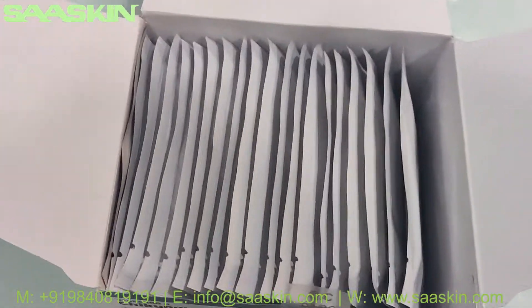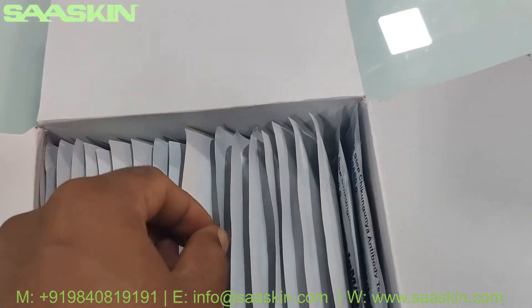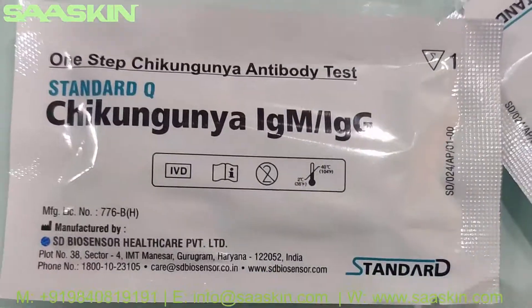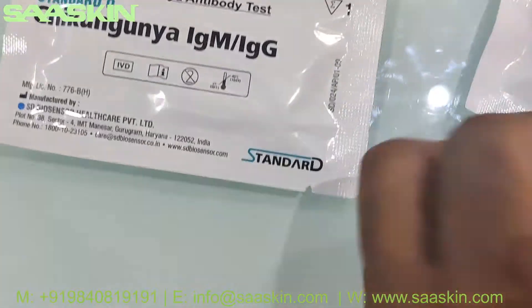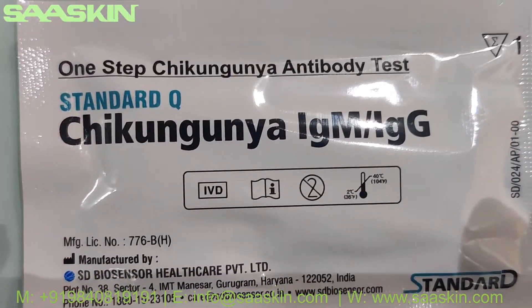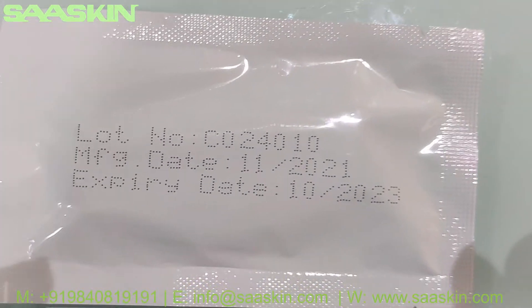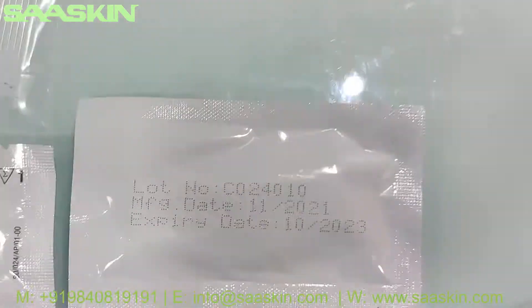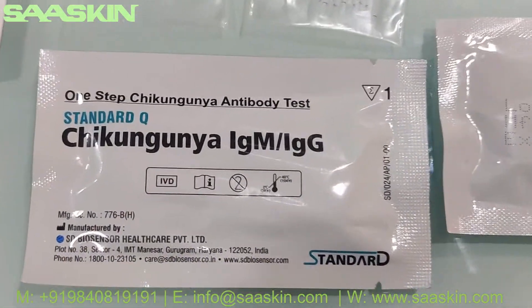Inside this 20-kit box you also have 20 test cassettes. Let me take two test cassettes to show you. This is the Chikungunya virus antibody detection kit — this is how the test cassettes look like. On the other side, all these test cassettes have a two-year validity from the manufacturing date.